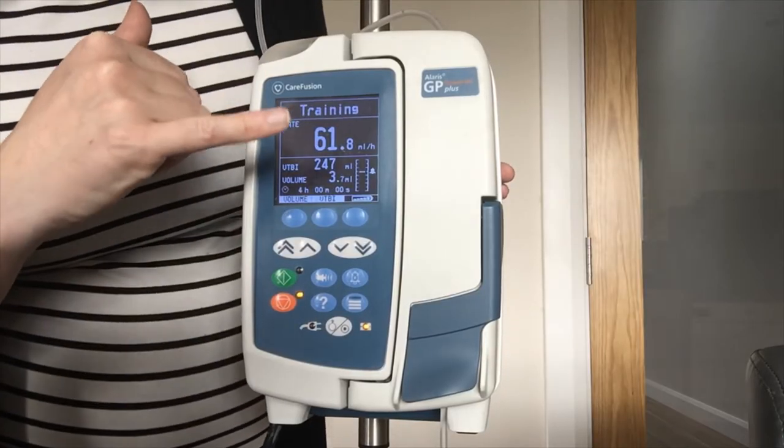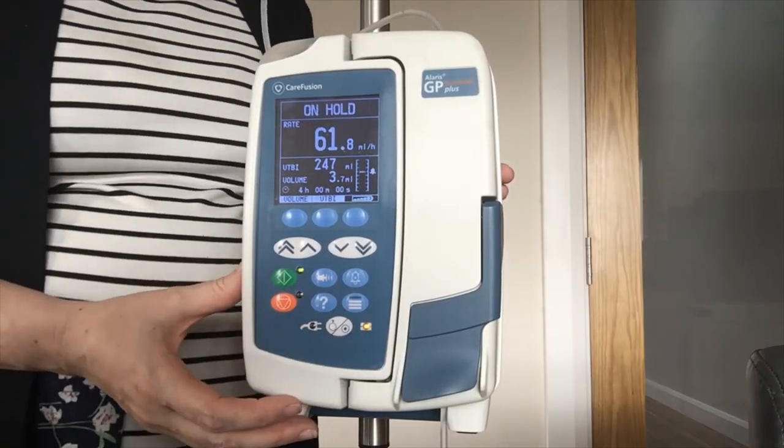There you have your rate, your volume and your time displayed, and you press green to run.